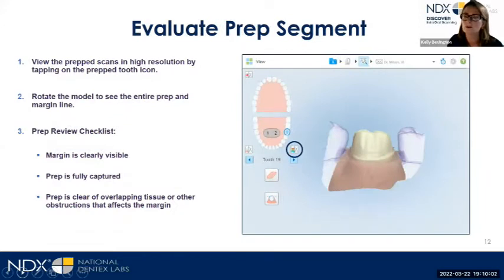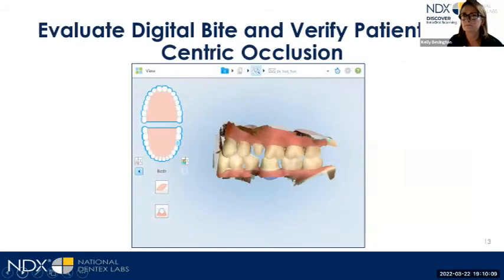Then you want to make sure that you're evaluating the prep itself before moving on to the segments.